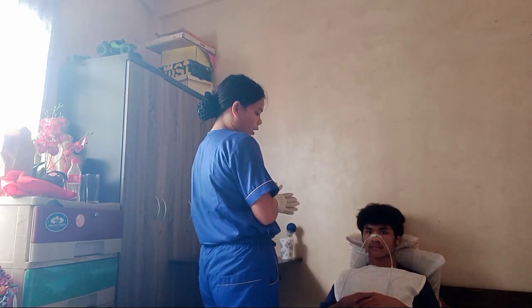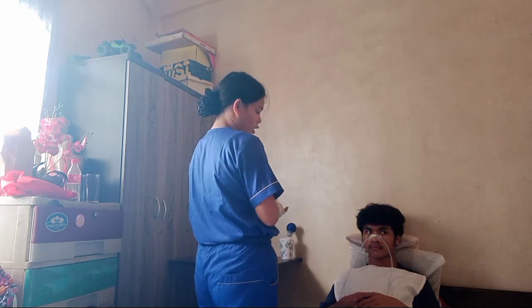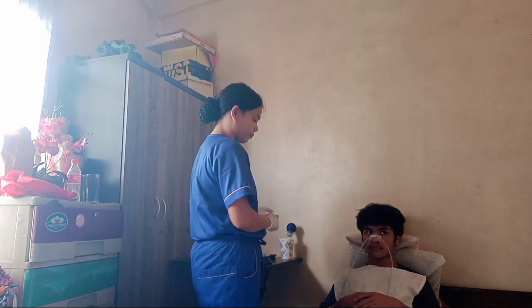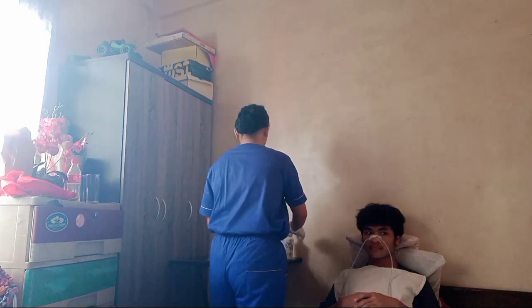Then after that, confirm the correct placement of the NGT every shift. Then check the residual amount. Then flush with a minimum of 25 ml of water.